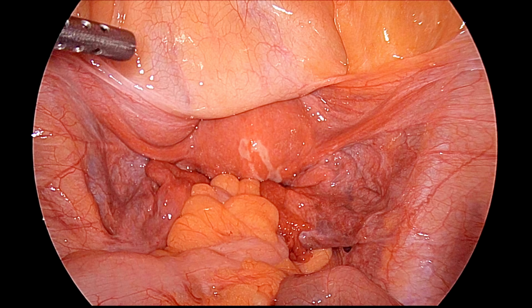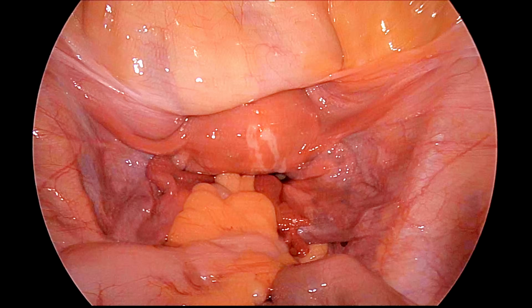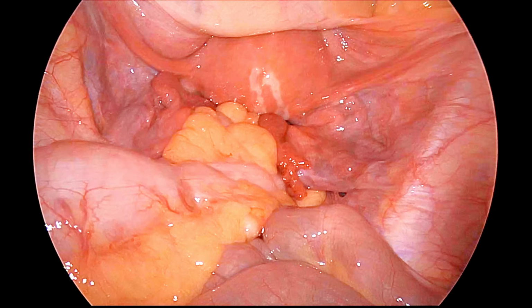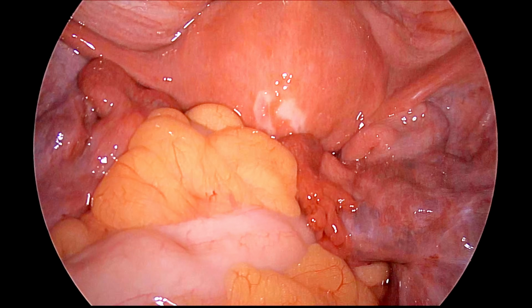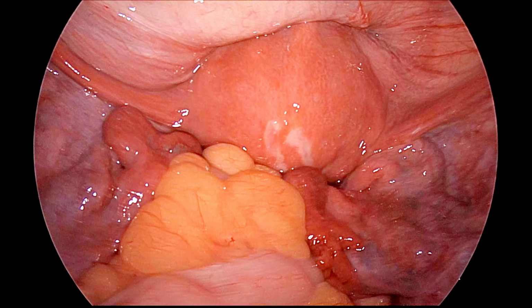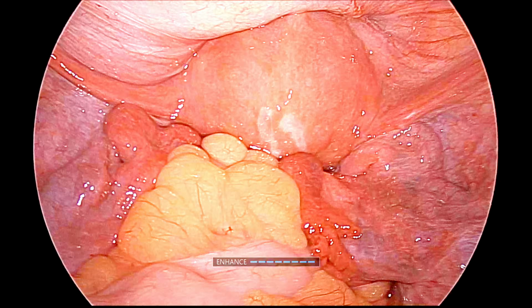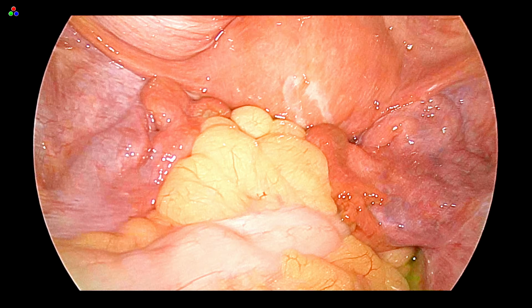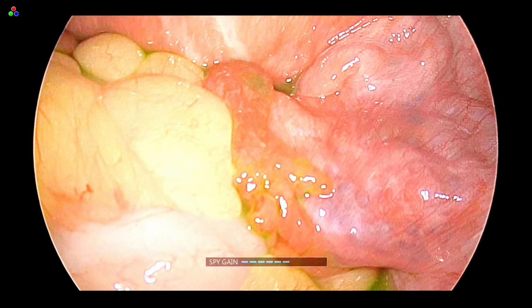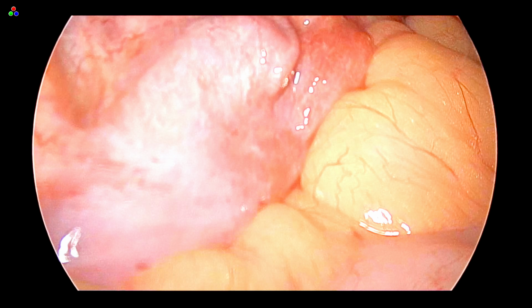After that we will remove it, and now again we are using the HSG cannula, and then we are injecting the ICG. Indocyanine green is what we use nowadays in the tubal patency test. We don't use methylene blue because ICG has a different mode. This is the digital enhancement, and it is enhancing the image. After that, you can tell the assistant to inject the ICG, and you can see the fimbria, the dye is coming on both sides.